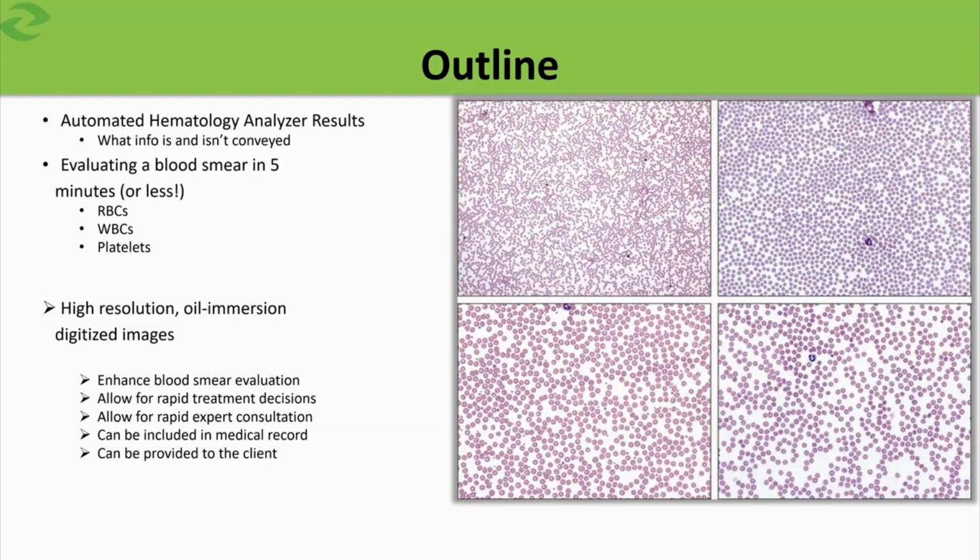Compare that to sending out a glass slide for a stat consult from a clinical pathologist. Even if you have close proximity to a laboratory, you're still probably looking at 6 hours to maybe 8 hours for a turnaround time, and getting a report back.